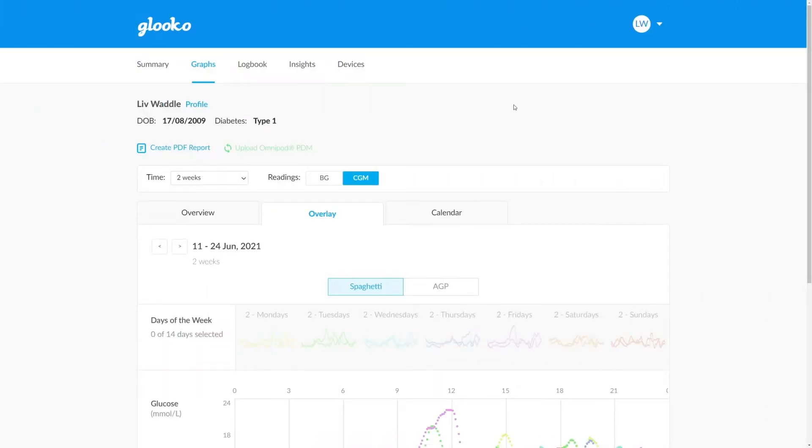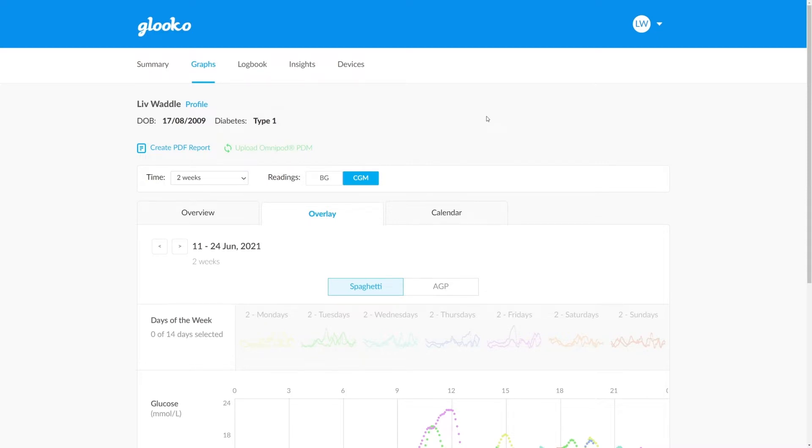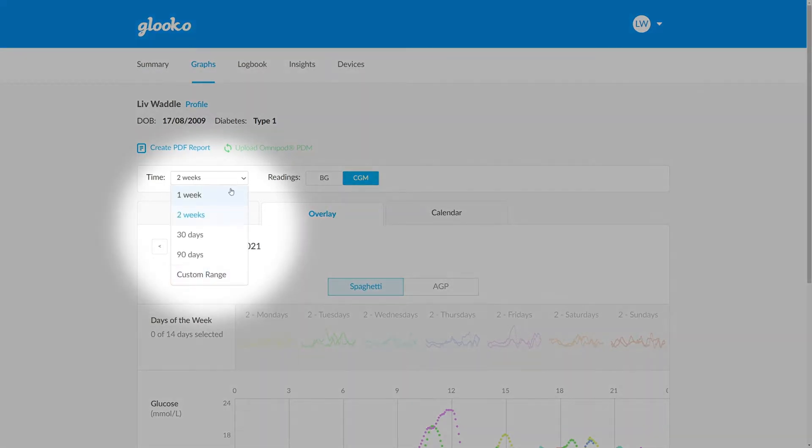The overlay tab within the graph section of a patient's profile is brilliant for layering up multiple days of data to get great insights into how patient lifestyle factors affect their control. First of all, we want to select the time period from the drop down.